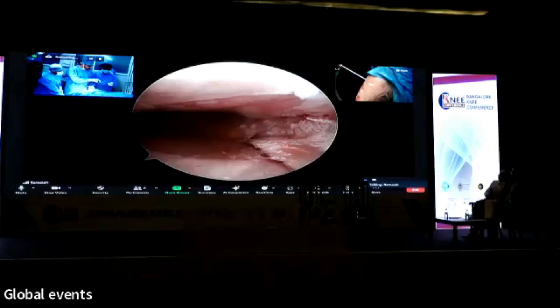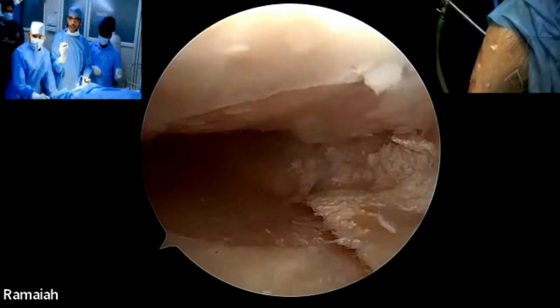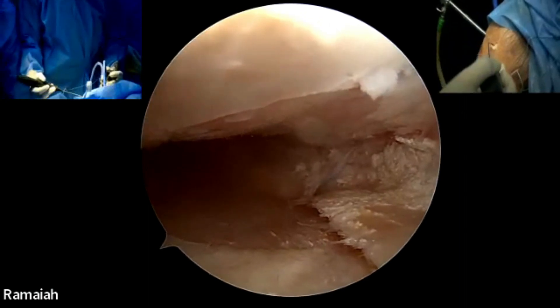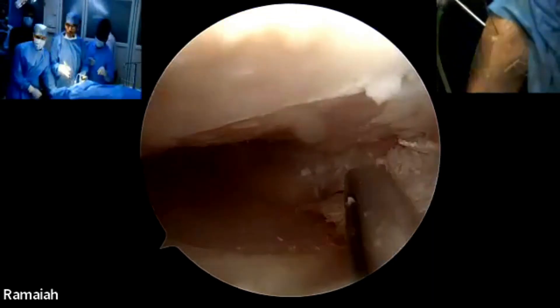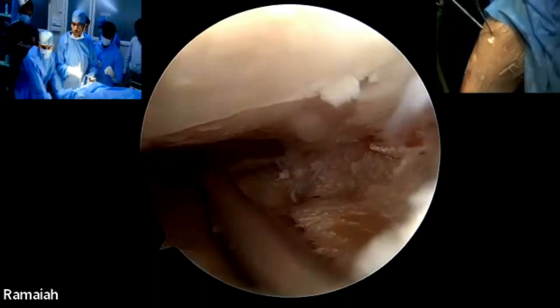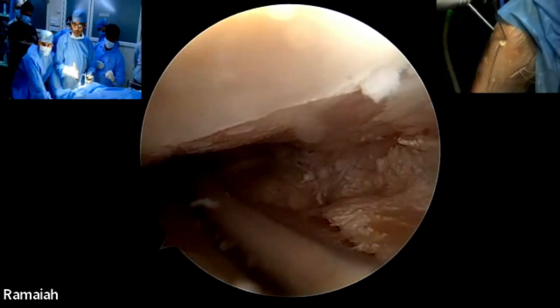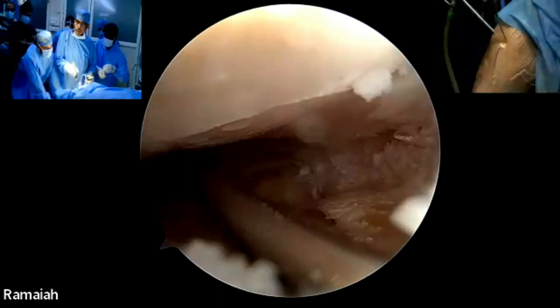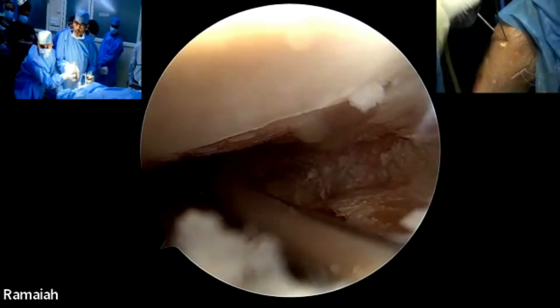Give the zone navigator to me. This one — you already loaded the needle but have not passed it through the tip; you just loaded it. So I am passing it through the anteromedial portal; it is going in here. I am going to do another stitch on the middle part of the medial meniscus. I have just kept it here, and now I am going to pass the needle — keep pushing it. You have to keep it on the place where you want to pass.